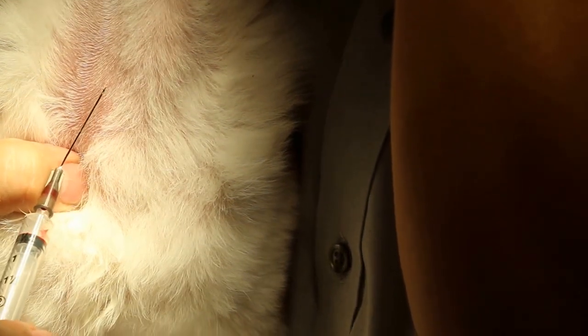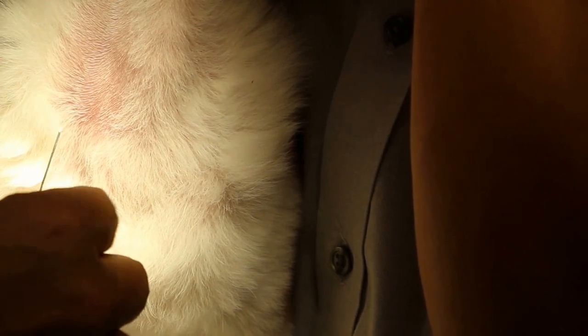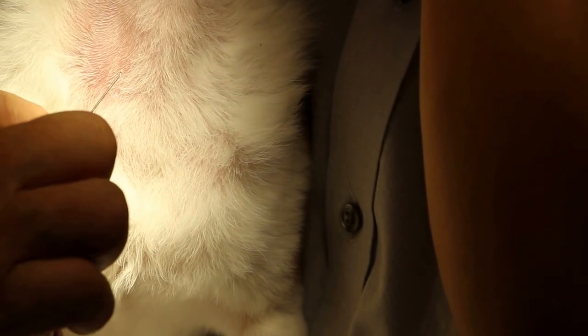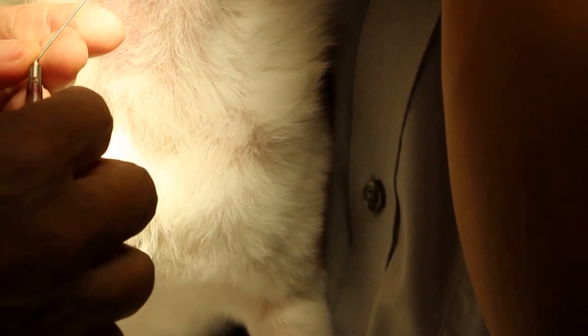Then of course you just draw the blood. You can draw even up to 3ml. Because if you get it right, it goes in only a bit — it doesn't go in a lot, just a bit. Then you just draw out. If we don't bend the needle it's very difficult, because the needle is straight, and that's why we have problems taking blood.